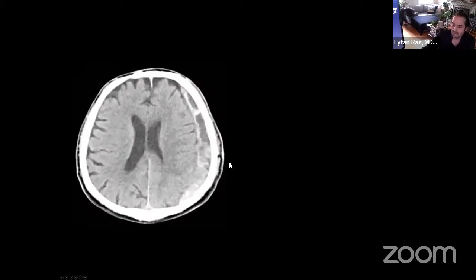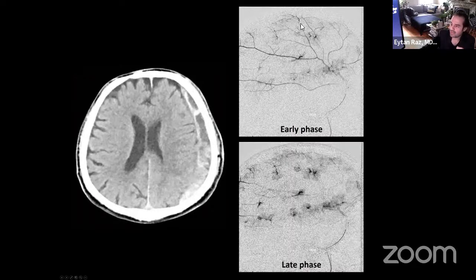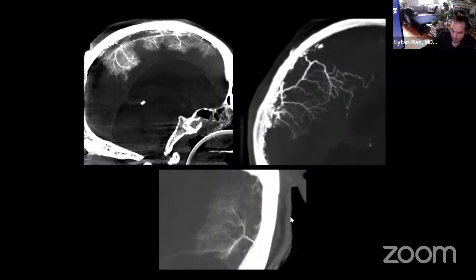When you do MMA embolization for something like this hematoma, it's relatively common to see this sort of blush filling of the membranes. Can this sort of imaging lead to a better understanding of the pathophysiology and the anatomy of this? We believe so, and we actually work on it. We did DynaCT on quite a few patients, and we started really seeing the vessel going deep. This is an axial view. You see how deep the supply to these membranes, the chronic subdural hematoma membrane, goes.